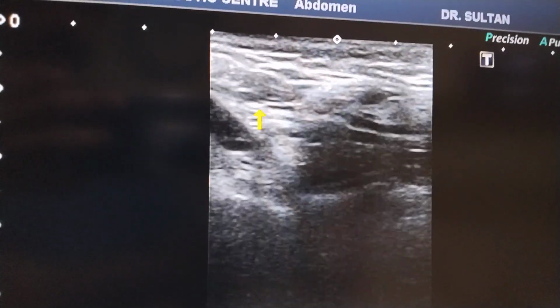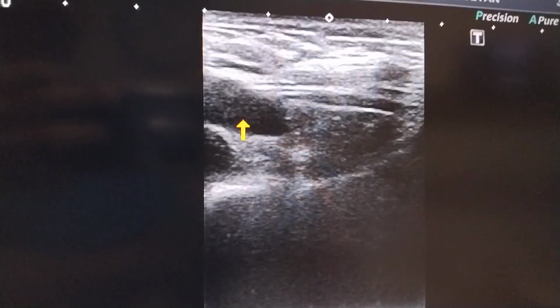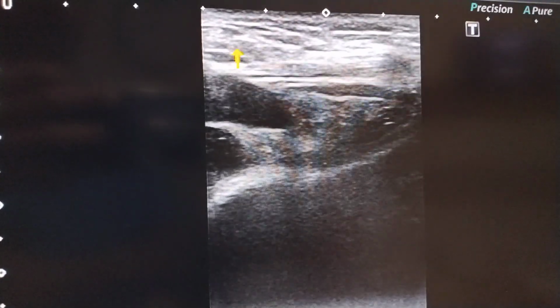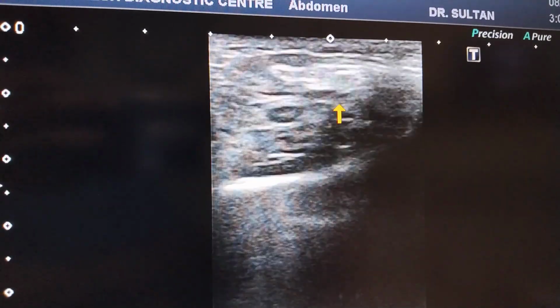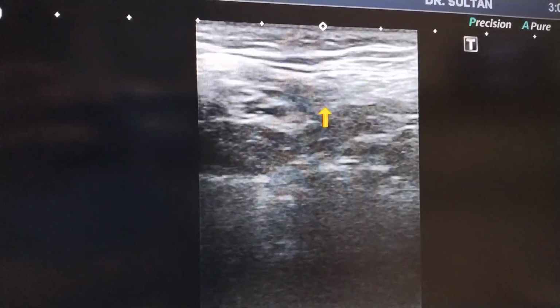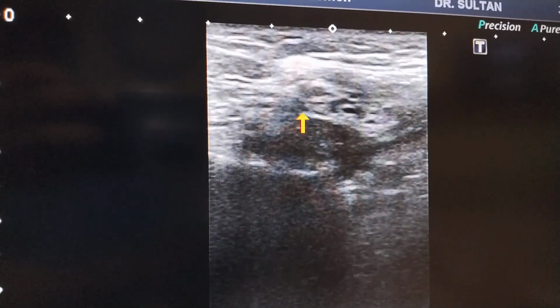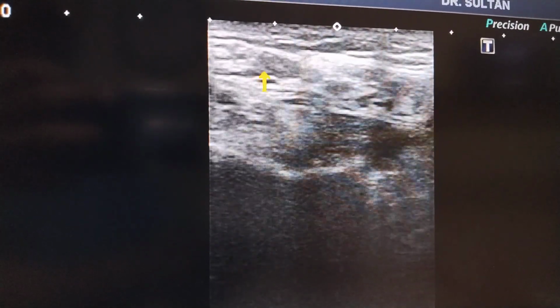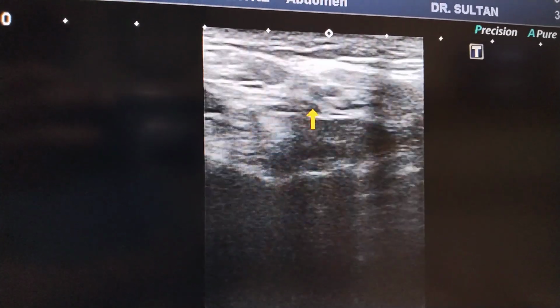This is the point where we can appreciate the femoral vessels, and this is the belly of the internal oblique. This is the spermatic cord of the male, with the vessel within it, dipping into this internal oblique belly, and this portion is the deep inguinal ring.